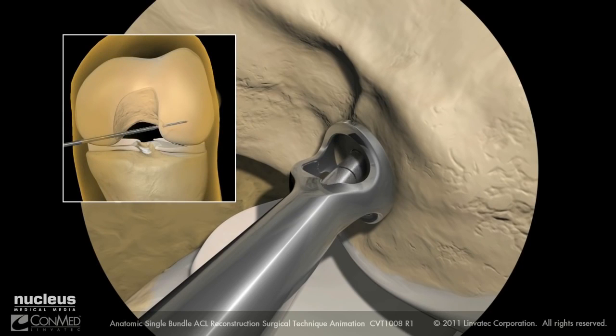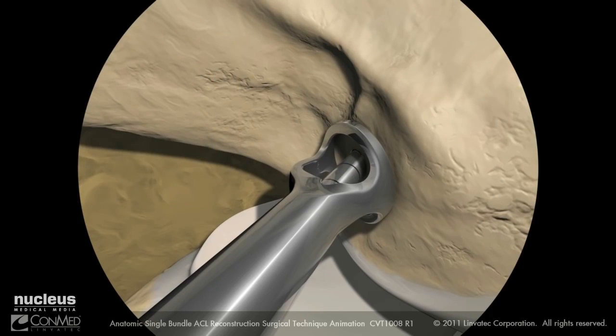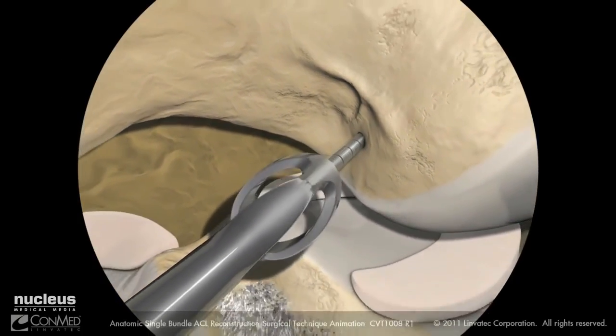Advance the guide pin to the lateral femoral cortex, noting the aperture to cortex depth, then advance it out of the skin. Continue advancing the guide pin out through the skin laterally, using a twisting motion to remove the femoral footprint guide.